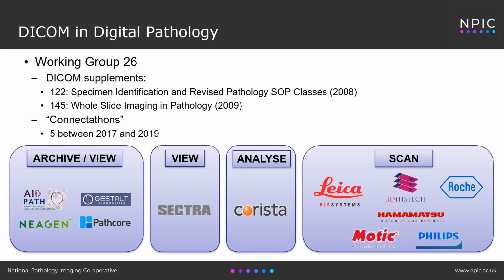I'm not going to go into too much detail about these, but for those who are more technically minded, they're both available in full on the DICOM website. But a published standard such as these is not much use unless it's actually taken up and used by vendors and manufacturers and can be demonstrated in real-world usage. So this was the second part of the fundamental input from this working group, the so-called connectathons.